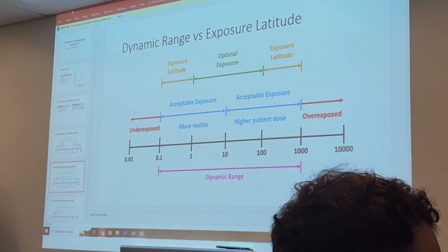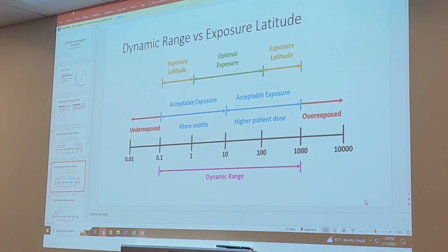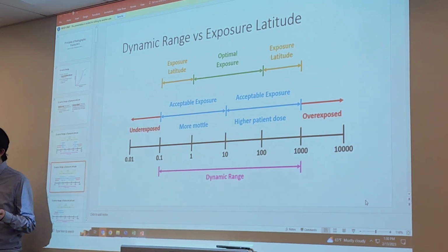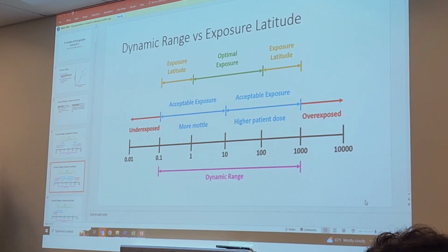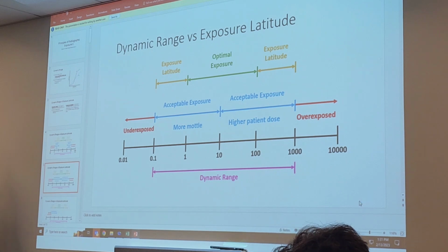Yes. Will the dead pixels always be together, or is it only one dead pixel? Or is it scattered? Great question. Ideally, it's only going to be just one dead pixel, or they're going to be scattered. But sometimes we end up with a whole row of dead pixels or a whole section of dead pixels. And if that happens, suddenly dead pixel correction doesn't work as well.